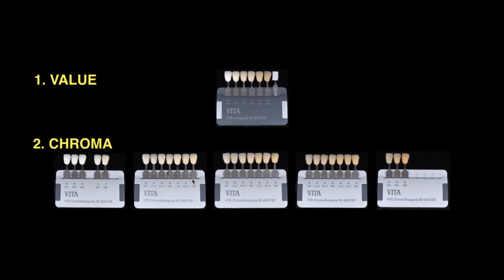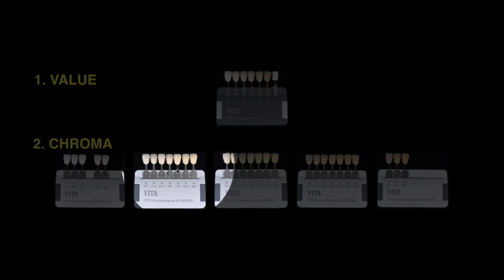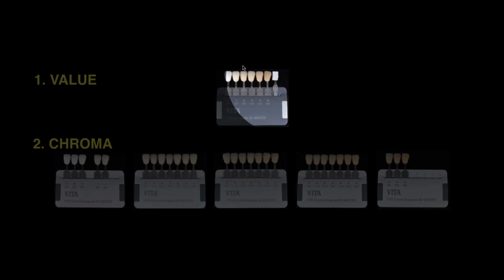So a simple way for you to think of it is, anytime I pick an L, that means it's more opacified or brighter. And anytime I pick an R, it means it's less opacified, more red influence. So now you understand, I hope, why I'm using this guide.